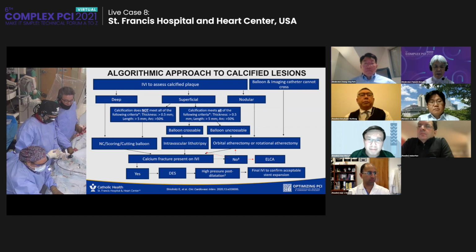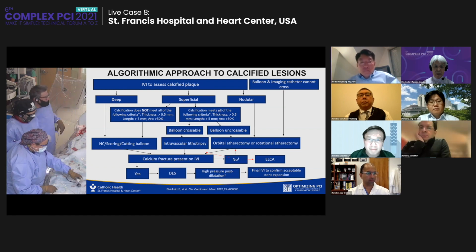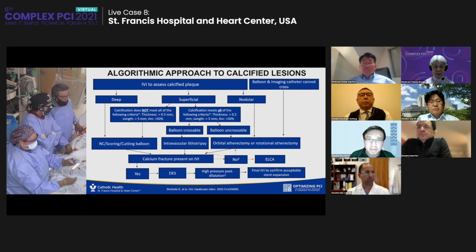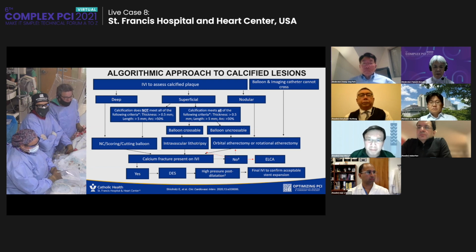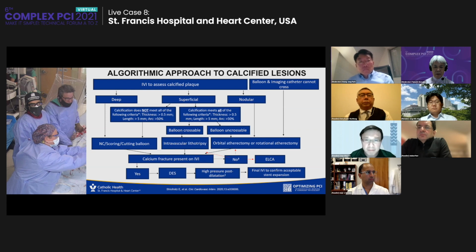We try to get 1-to-1 in the areas we shock. In addition, with OCT, I can have co-registration. I have 80 pulses per catheter, and I want to maximize my pulses where the most calcium is. In Shockwave, ideally greater than 270-degree angular calcium is preferential to get the best effect of the energy. If a lesion is long, as in this case, and there are areas I don't need to shock, I want to concentrate on the calcified areas.